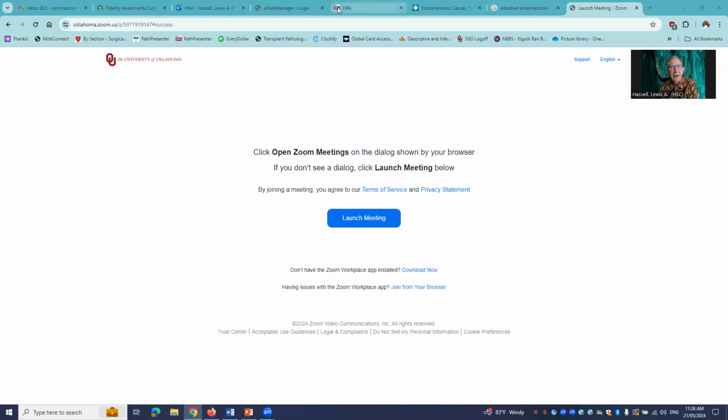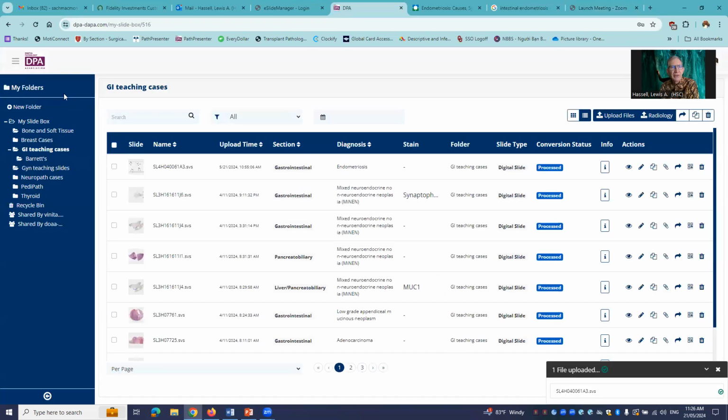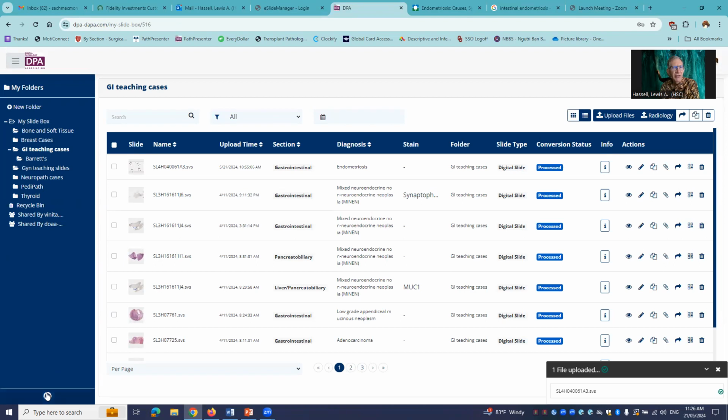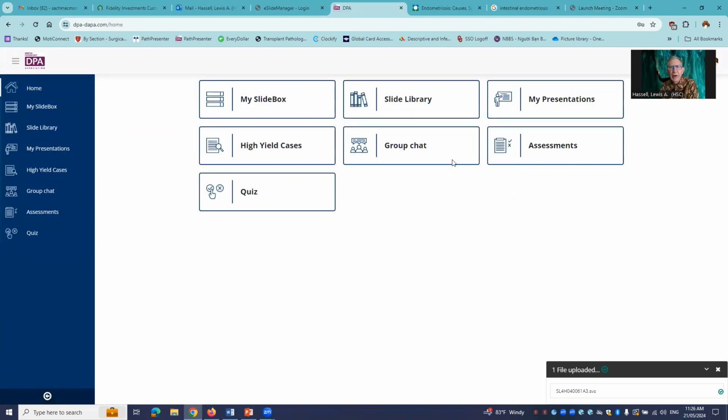So I'm going to share my screen and illustrate how I do this in this video. So here's my screen, and I have here the window for the Digital Pathology Association Path Presenter. We'll just go to the home page, so that once you've logged in, you see an array of options such as this. And we're going to use the My Presentations option, as well as the digital slides that are available either in my own personal slide box, cases that I have uploaded, or from the public slide library.